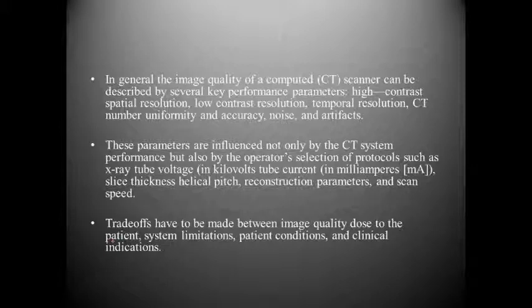We know that trade-offs have to be made between image quality, dose to the patient, system limitations, patient conditions, and clinical indications. So we know there is never going to be a perfect ideal situation, especially when you're working in a hospital setting versus an imaging center. While an imaging center typically has more walking and talking patients, hospitals, if you're doing throughput from the ER, typically may not have an ideal patient.